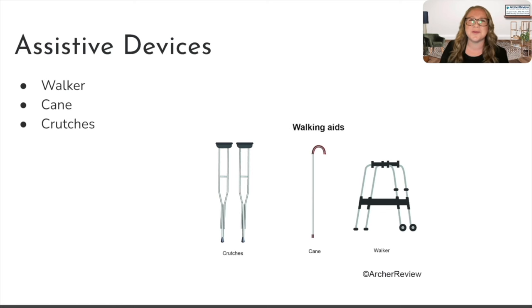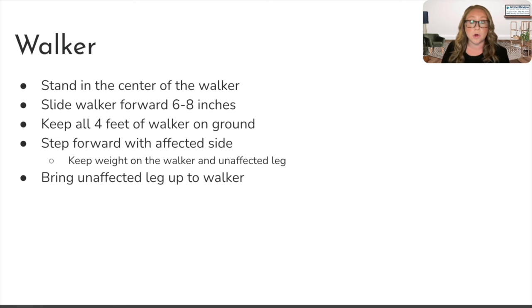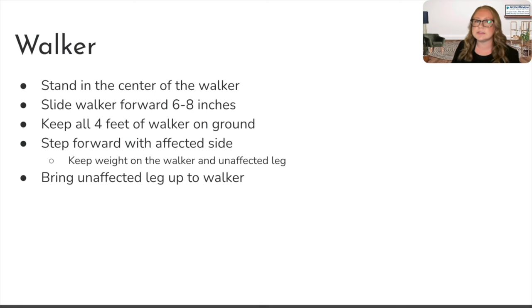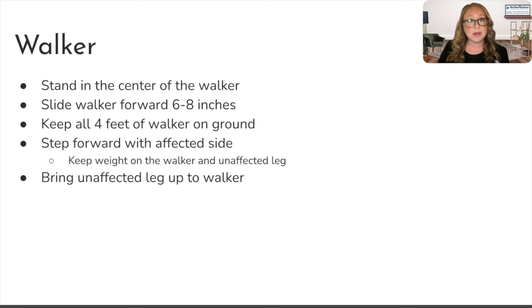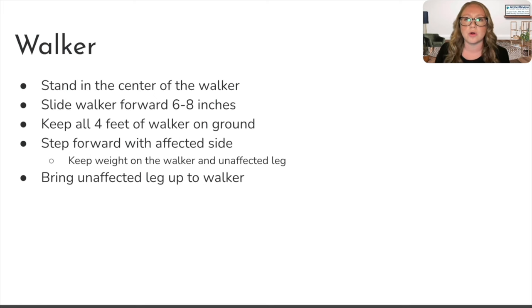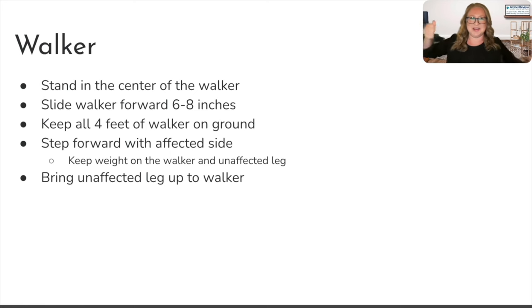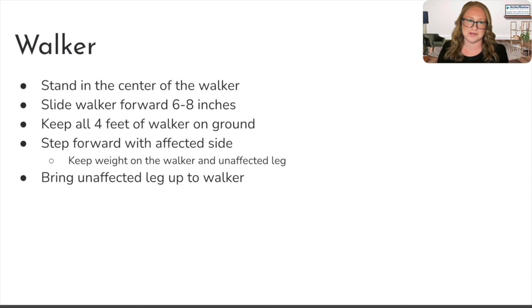Let's start with the walker. When your client is using a walker, they should be standing right in the middle of it — not off to one side — right in the middle so they have good balance. The walker is going to go forward first by about six to eight inches, depending on the size of your client. It's really key to make sure they keep all four feet of the walker on the ground. We slide it forward, keeping all four feet on the ground.